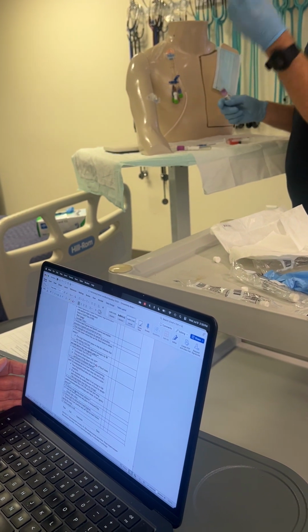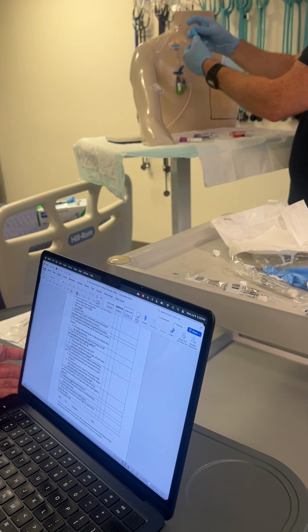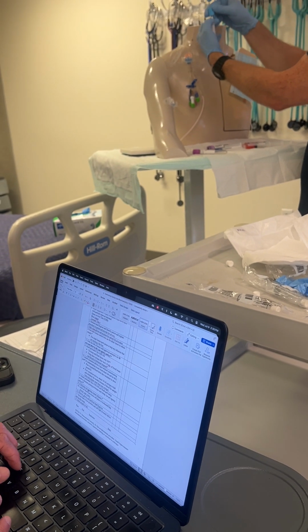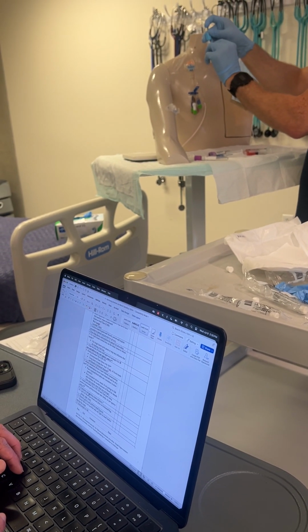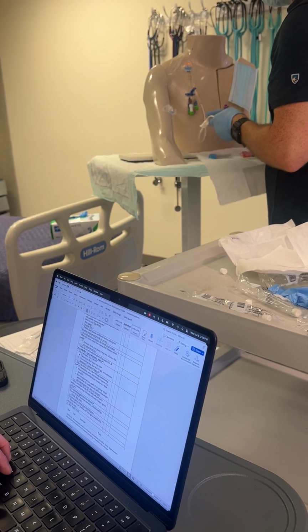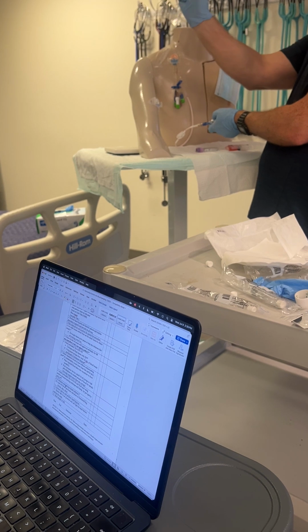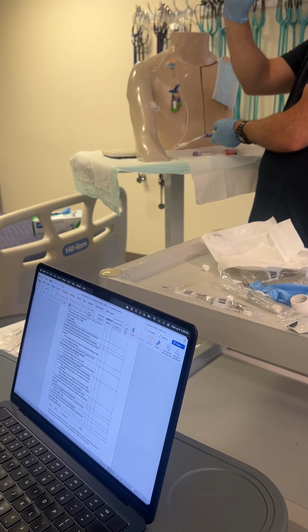Typically with a coag, you waste blood before you just draw straight to a blue tube. The reason is a blue tube needs to be filled all the way to here. If you don't waste a little bit, it doesn't get filled all the way and they'll reject it. Just a little pro tip. So with the blues, they don't often fill all the way up, so you use a waste tube before you draw.